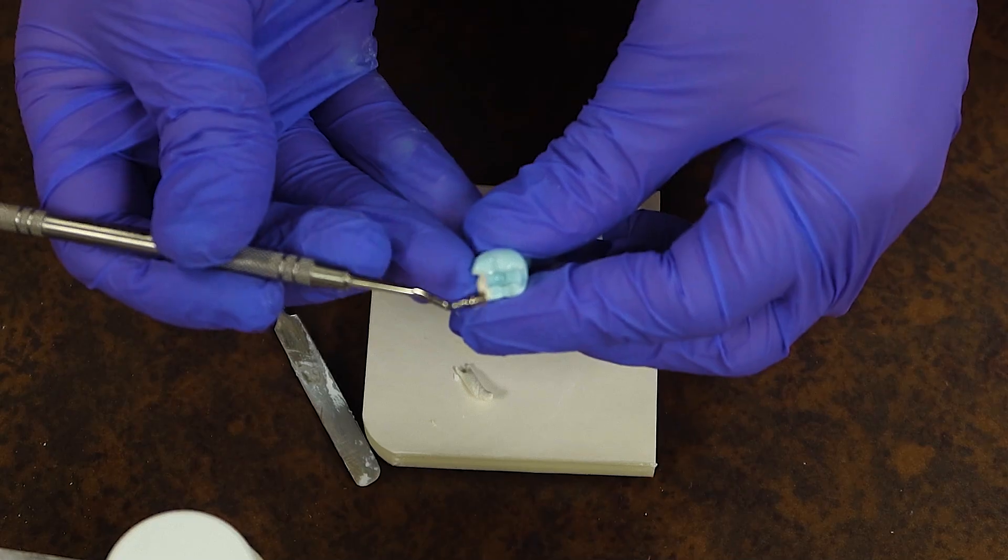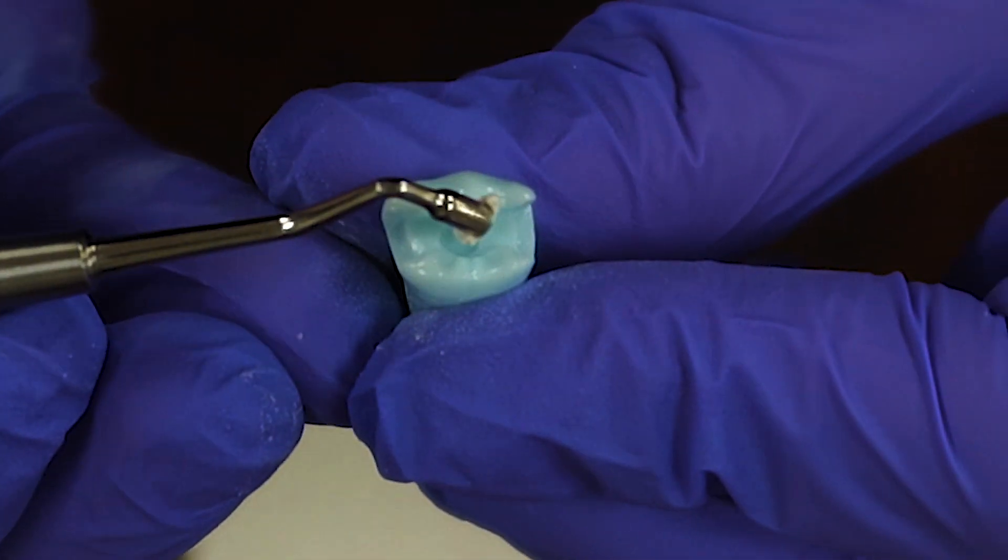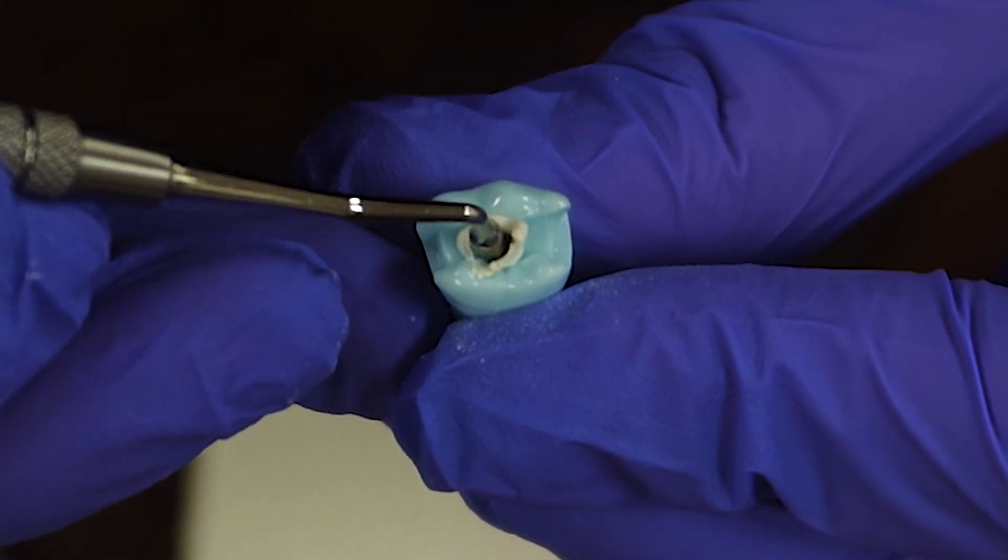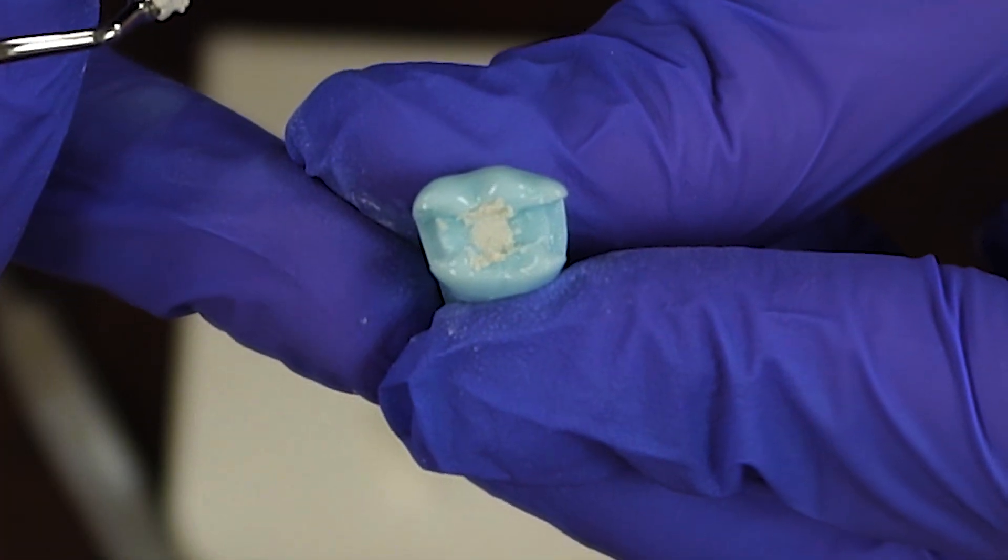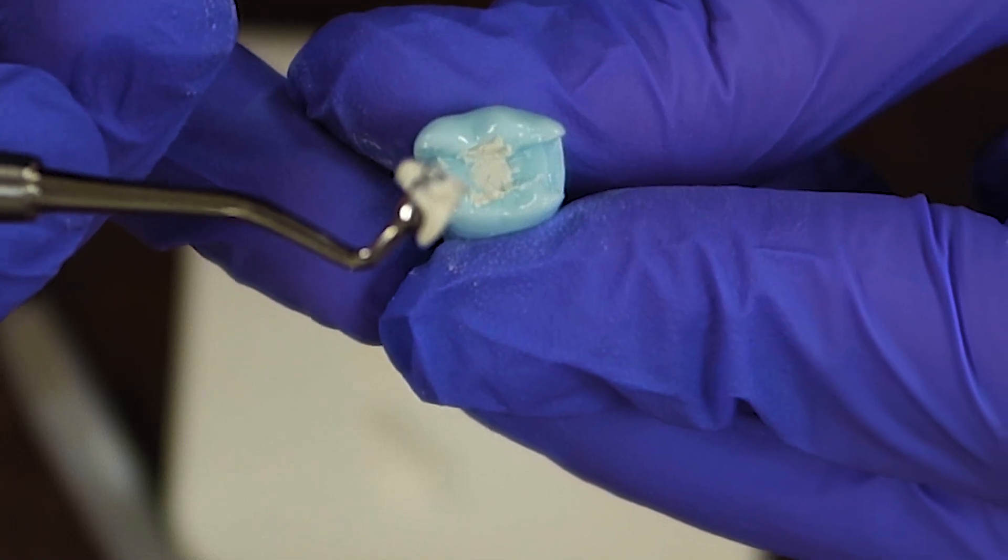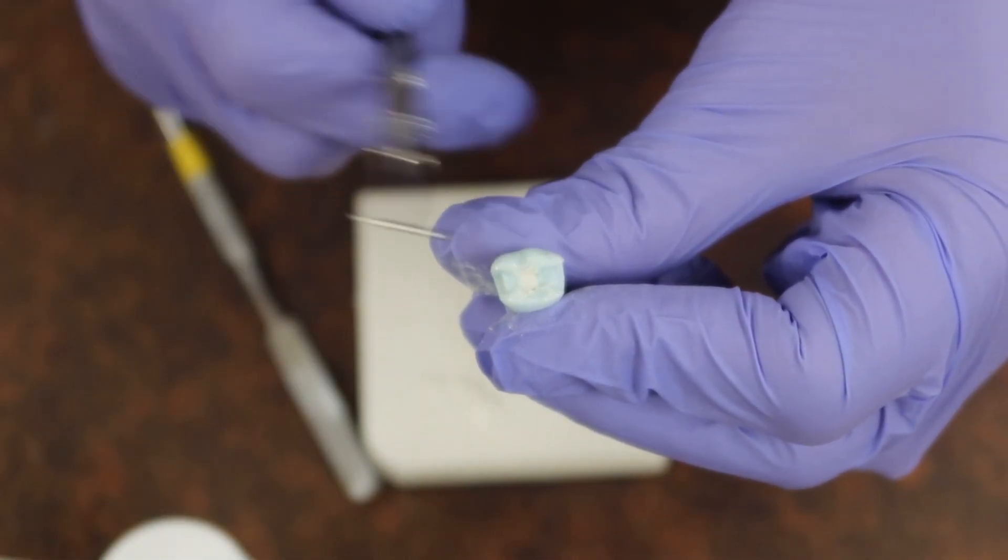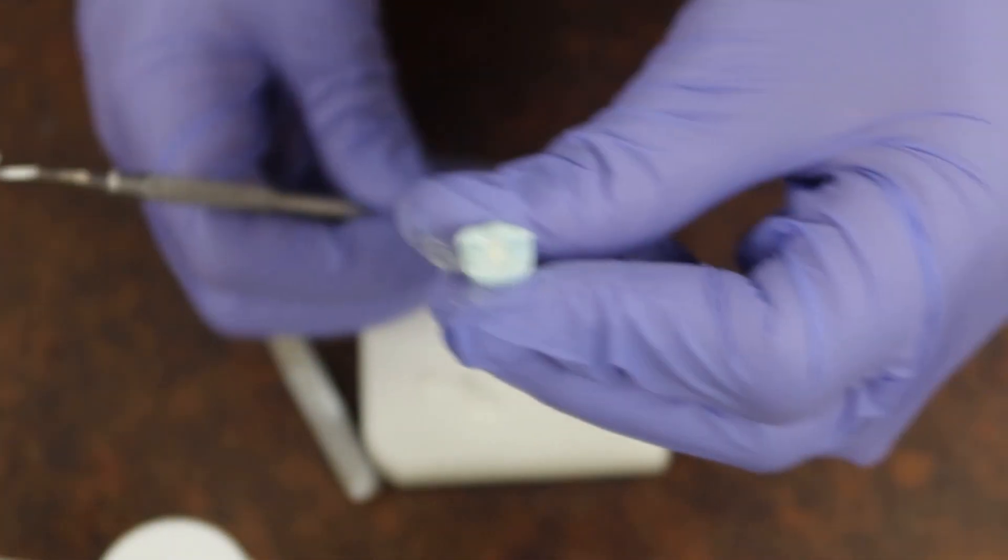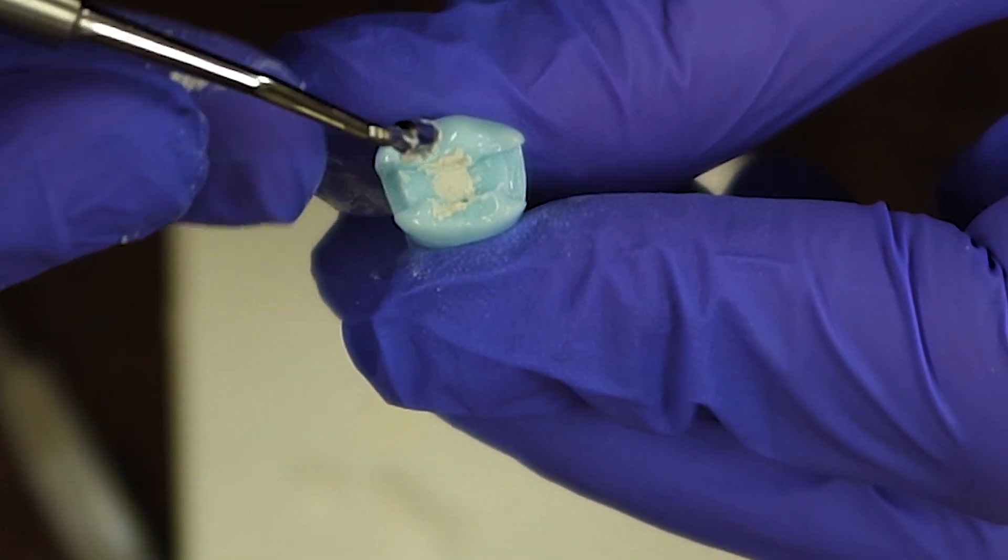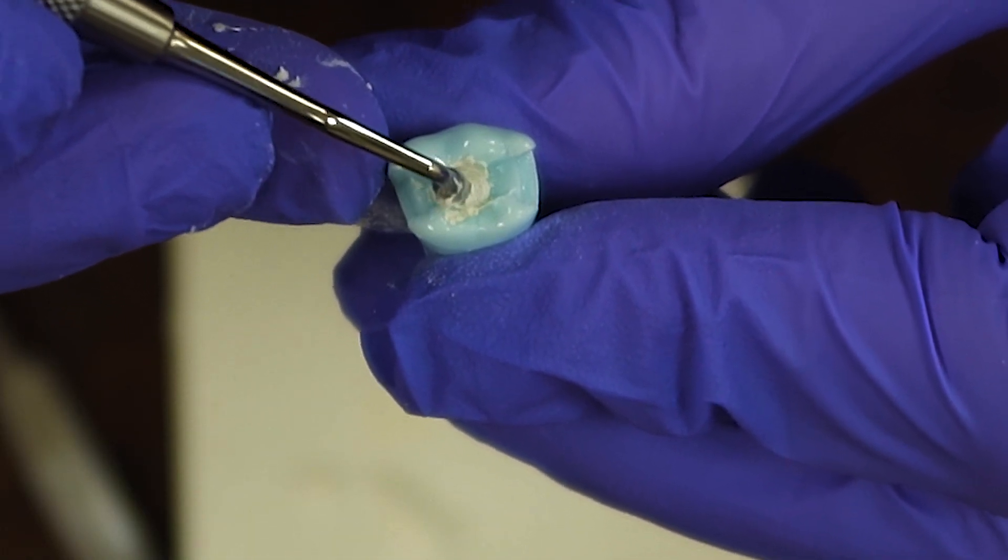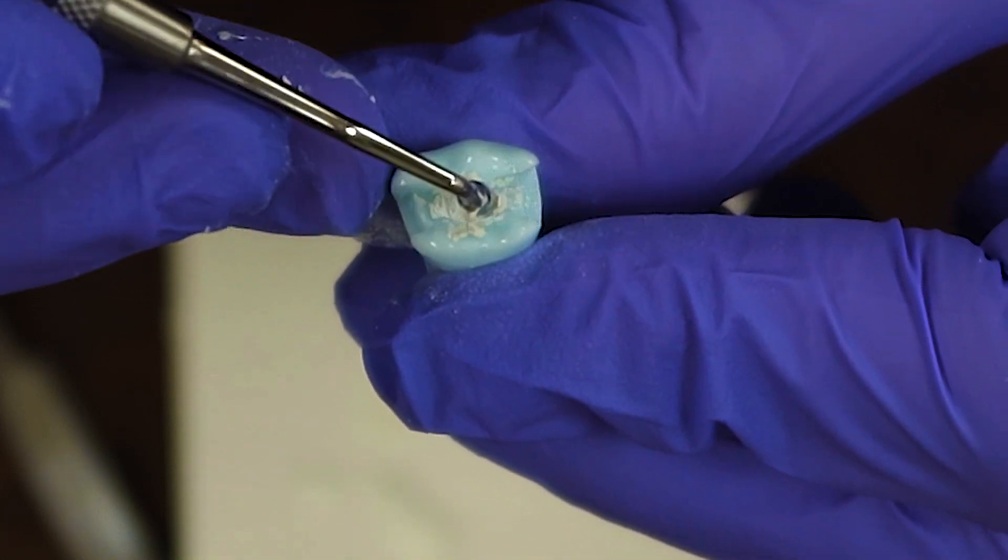We're going to take this material to the tooth and place it right in the deepest area, making sure that it covers the ice cream scoop portion. If you're not able to completely condense the material because it keeps lifting, get a little bit of powder and put it on the end of your instrument. This allows you to pack it a little further, swiping off to the side, making sure it's nice and level.